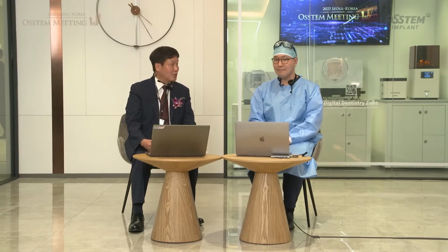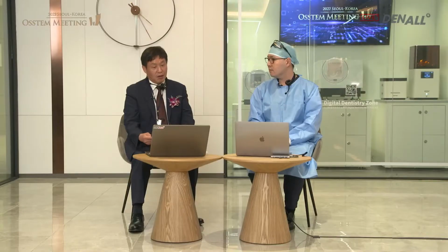Thank you for the presentation. As you said, in Korea, all-on-X is controversial, but using a case similar to this, I think you gave us a very good explanation. And let's go to one more question. If the panorama is ready, let us know.